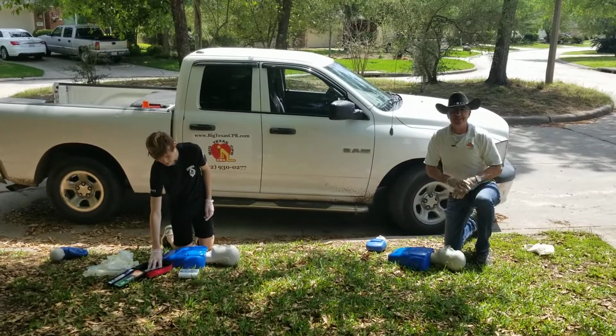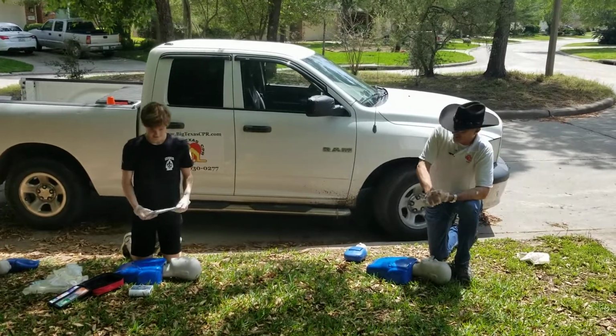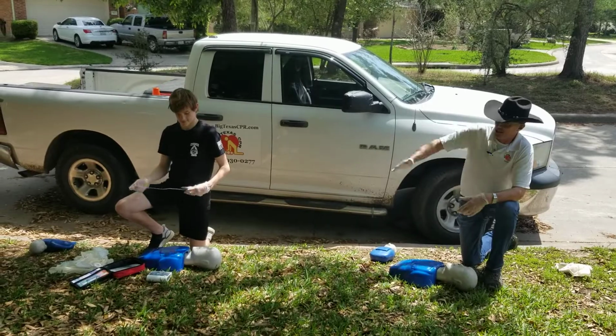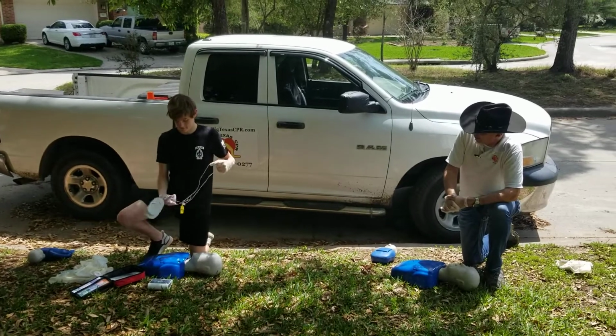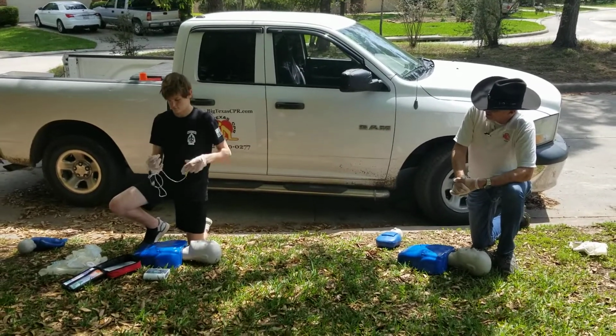And for later reference in this video, welcome to 2020 and the COVID-19. So 4 years from now, when you look at this video, look it up. You'll understand why this distance is important. So that's a trainer AED. There's no live shock coming out of it.